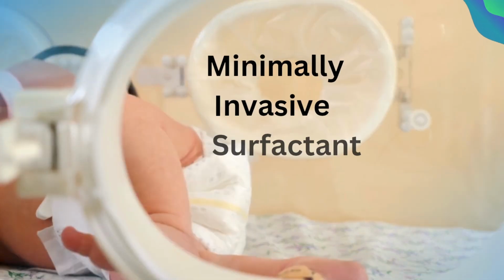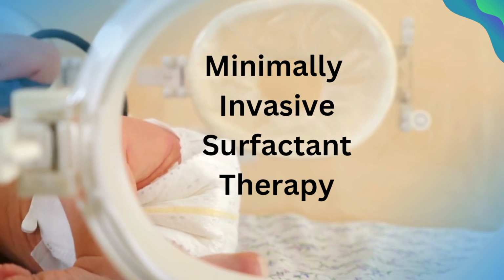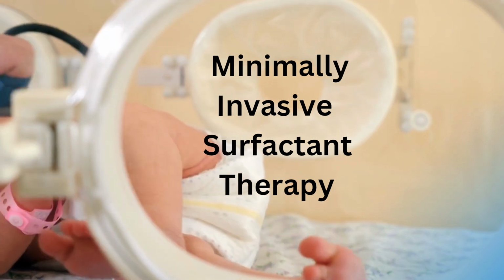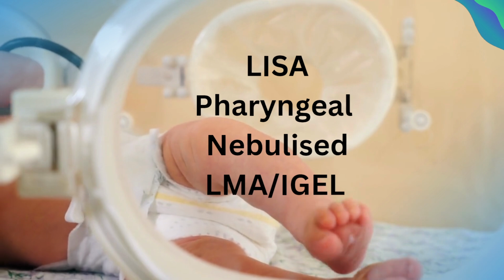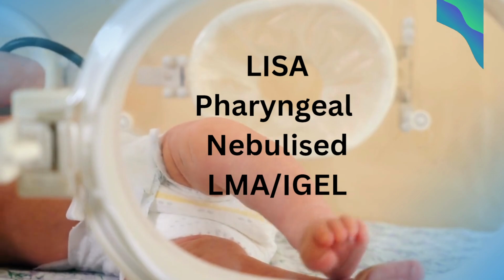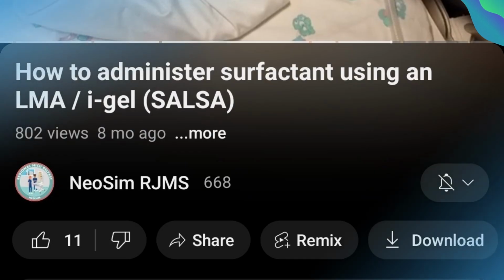MIST stands for minimally invasive surfactant therapy, and it covers a number of different methods of administration. This includes LISA, as in this video, oropharyngeal and nebulized surfactant, and also administration via laryngeal mask or i-gel. Some units are using this to administer surfactant. We are not teaching this method in the video, but please watch our sister channel NeoSim's very useful video on this topic. The link is at the top of the video.